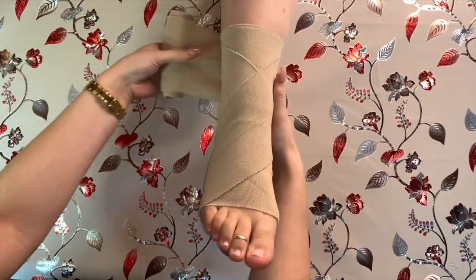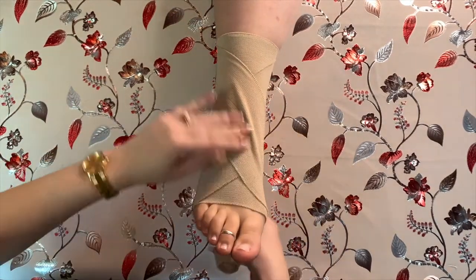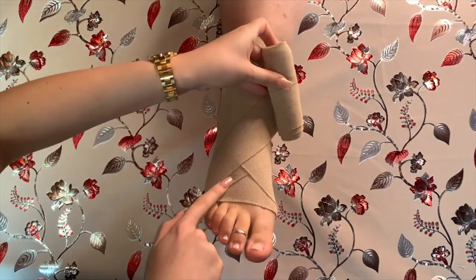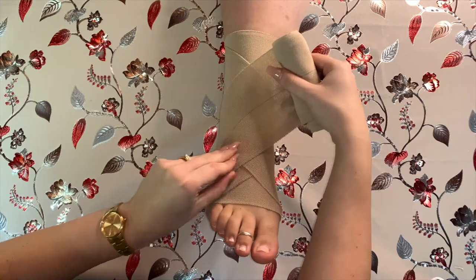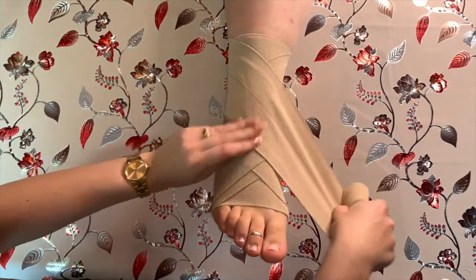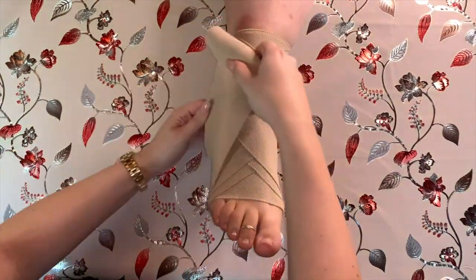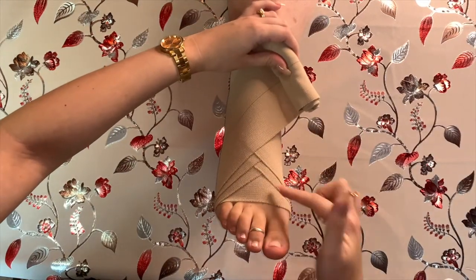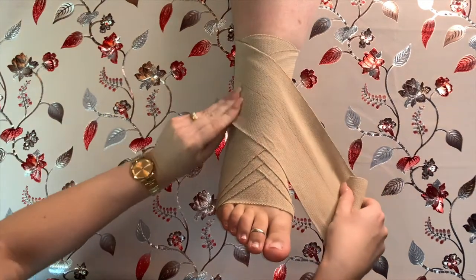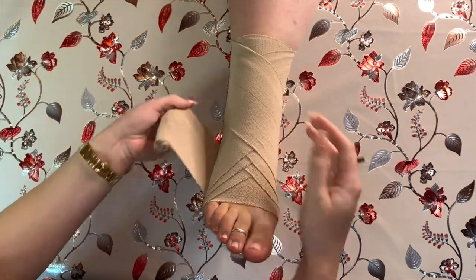Bring the bandage up towards the calf on the side of your dominant hand, wrap it around the back just below the calf, and then back down towards the toes to make a figure-of-eight pattern, smoothing the bandage as you go. Continually follow this figure-of-eight pattern, but every time you bring the bandage back up towards the calf, move it one centimeter over from the first line to create a V-shaped point in the center of the foot. This creates a braid-like pattern on the front of the foot. Remember to pull it firmly but not too tight, so you don't slow or cut the circulation of blood.